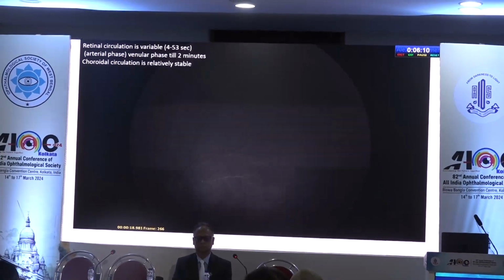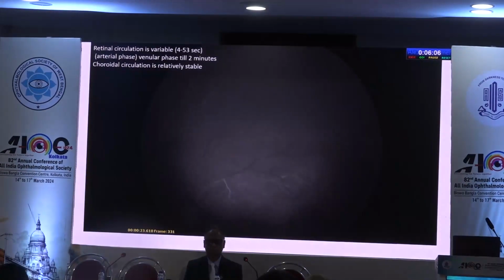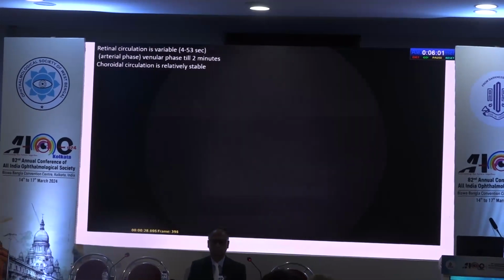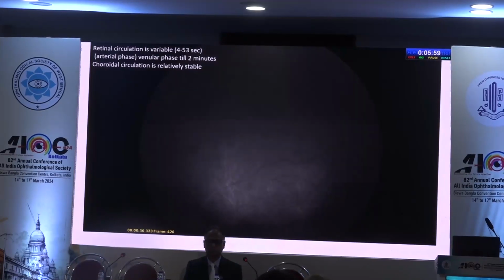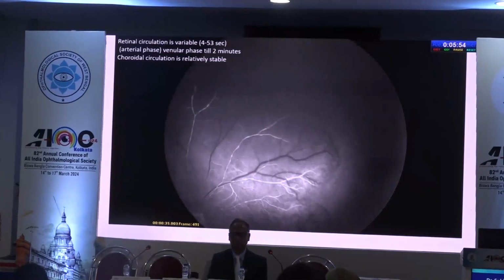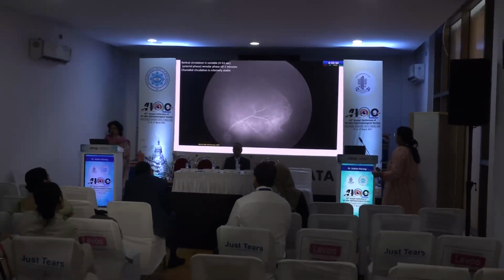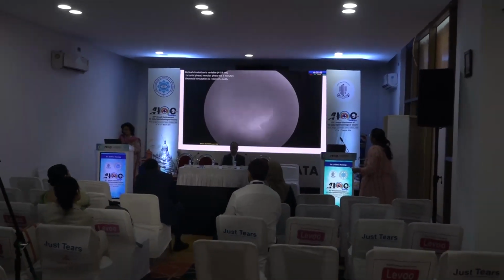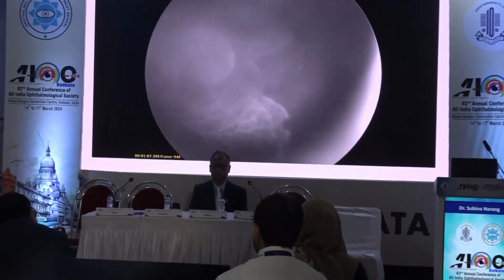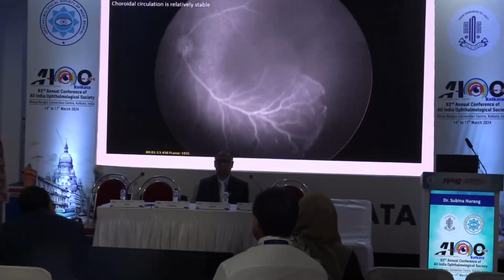You see the choroidal vasculature filling in, then the retinal vessels filling in, and you must focus at the junction of vascularized and avascular retina, and you would pick up a lot of things. And be careful that you have to be recording the temporal, nasal, and superior and inferior part of the field, and I do it under topical anesthesia, because general anesthesia is usually very difficult, and it works pretty well for these.